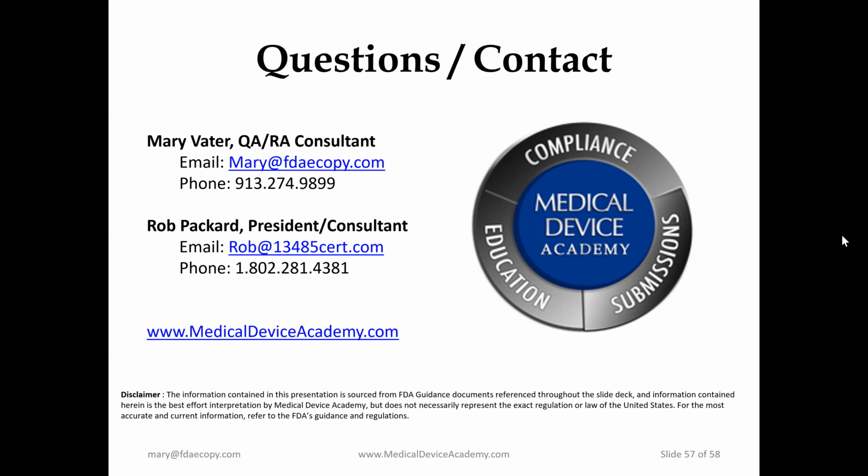Whereas SOUP is software of unknown provenance, and somebody else also put in a good comment that SOUP is open source or configurable to some degree, so it gives more control to the manufacturer. That's right, and that's a good point, because sometimes you can do more verification and validation when you have that open source code, but you typically have less information about where that code has come from, or what development activities were done to build quality into that software. So those are the main differences.